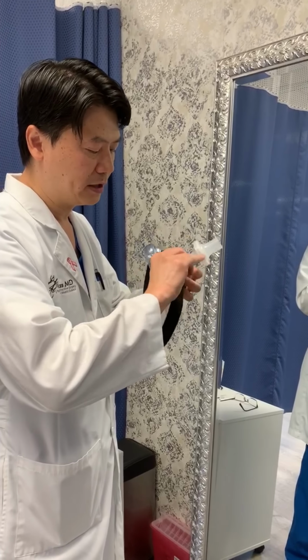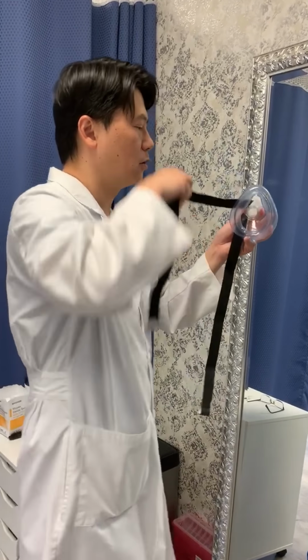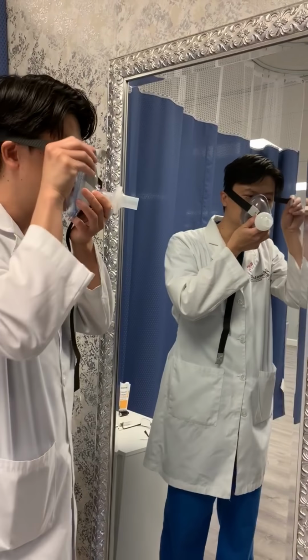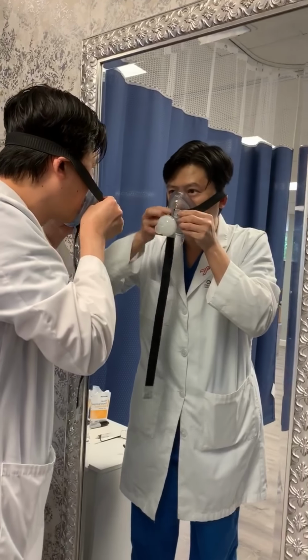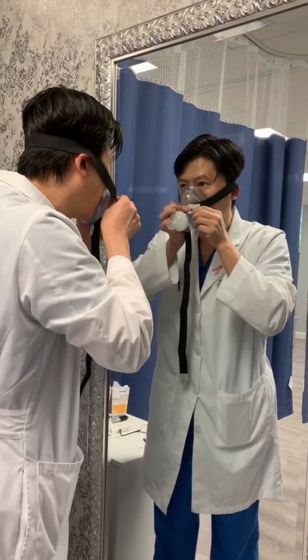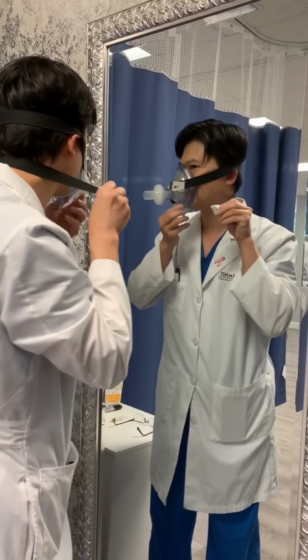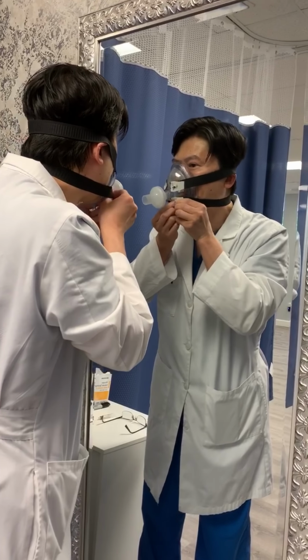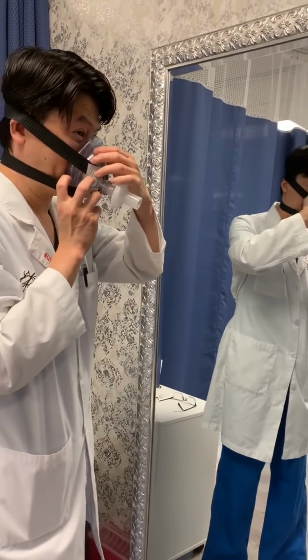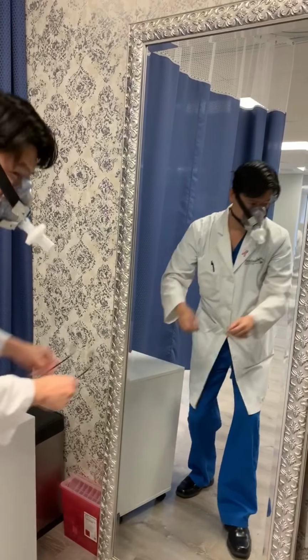On one side, just gently remove the elastic strap. Place it over your face and nose. Bring the top strap over, and it's easier to do it in front of a mirror. Now I proceed with the bottom strap, which goes around your neck. You can adjust the mask on your mouth and nose. And put your glasses back on.